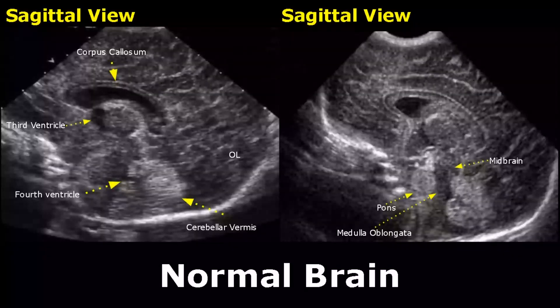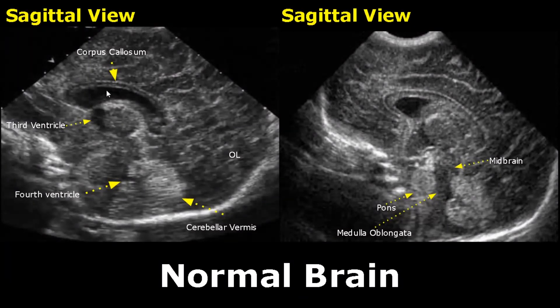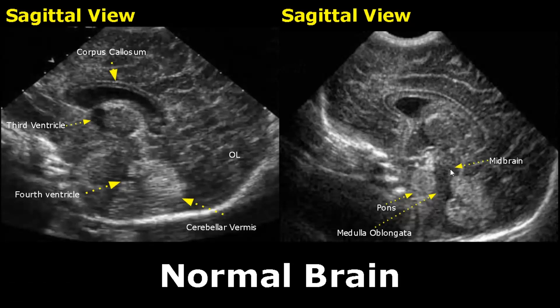These are sagittal views of a normal brain in a full-term infant. This layered structure is the corpus callosum. Below that, the anechoic area is the lateral ventricle. Below the lateral ventricle is the third ventricle. As we go down we will find the midbrain, the pons, and the medulla oblongata. Behind these is the hyperechoic cerebellar vermis.